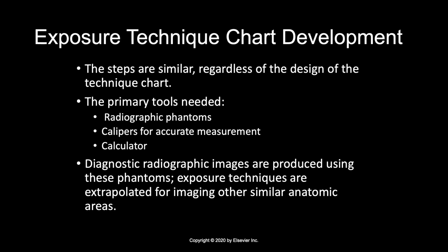And comparative anatomy can assist the radiographer in determining the minimum KVP. This is a concept that states that different parts of the same size can be radiographed by use of the same exposure factors. So we need to know the minimum KVP needed to penetrate the part, and then we can figure out the KVP to use on each part of the entire body.